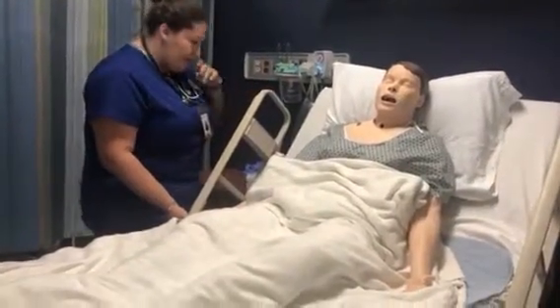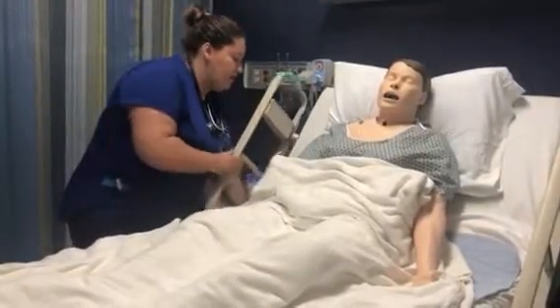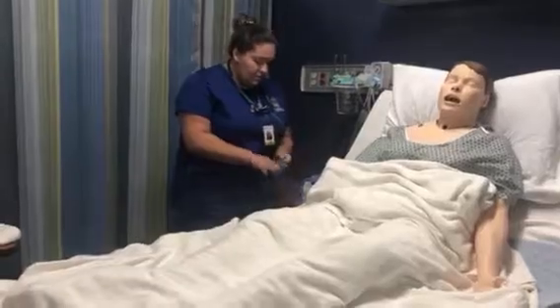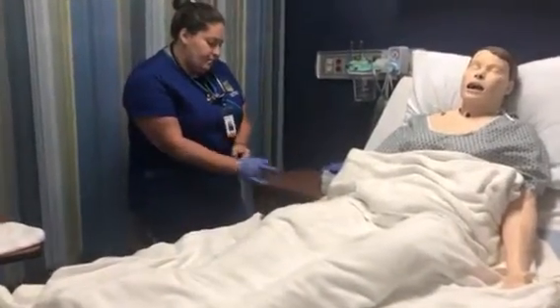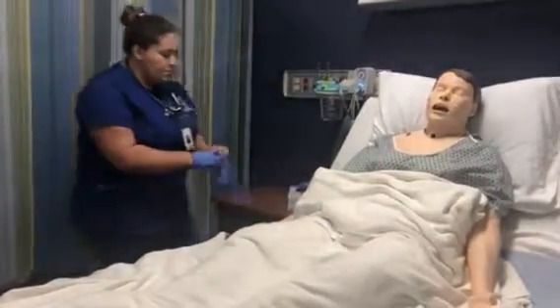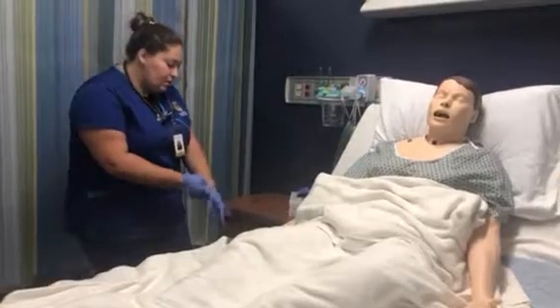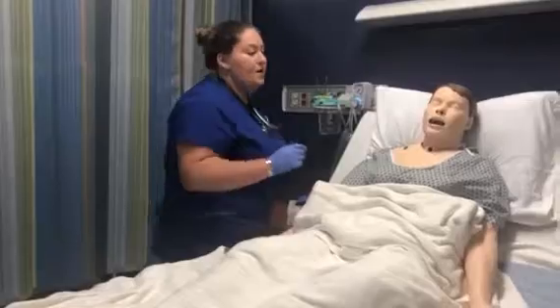Raise the bed to hip level. It's more comfortable. Put down the side rail. Okay, perform hand hygiene. Put on clean gloves. Okay. I'm just going to check the patient for bilateral patency.